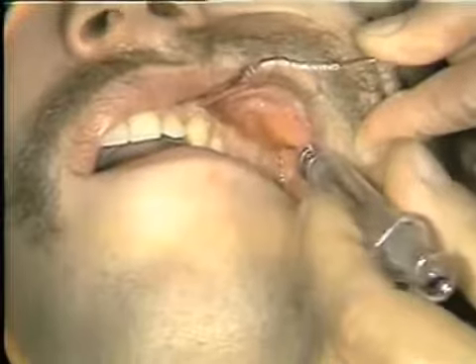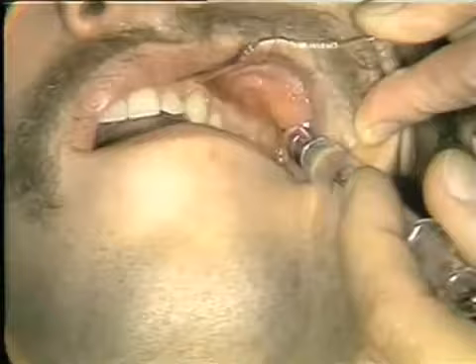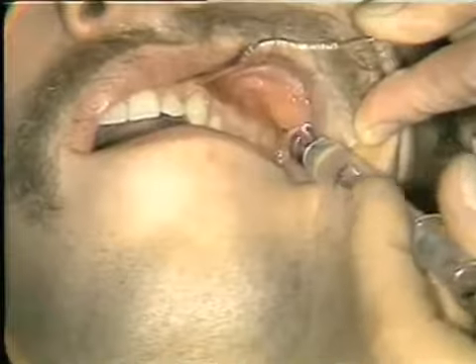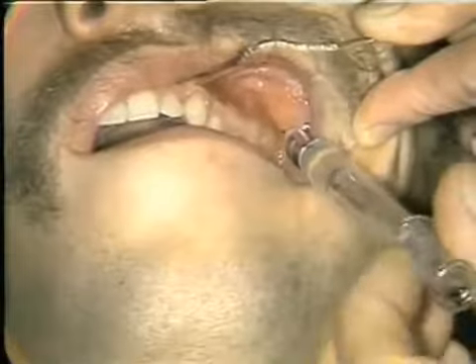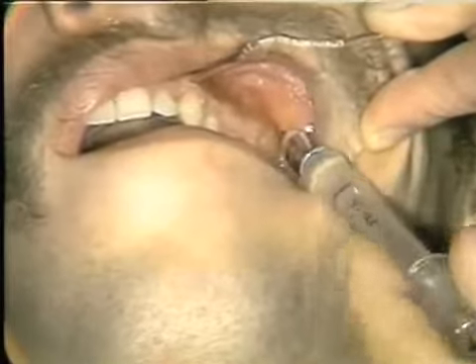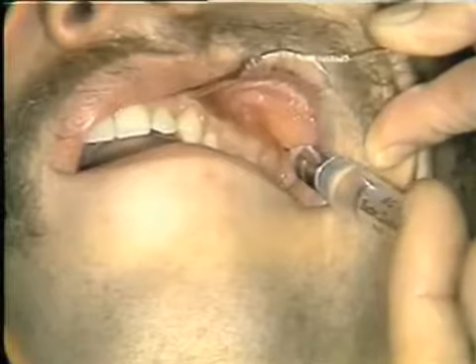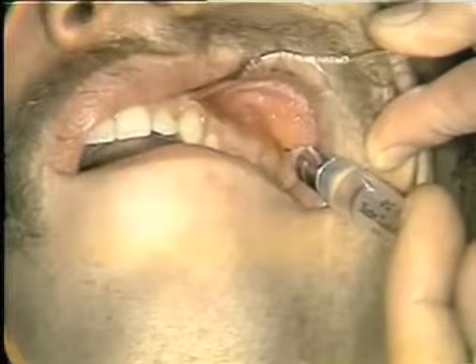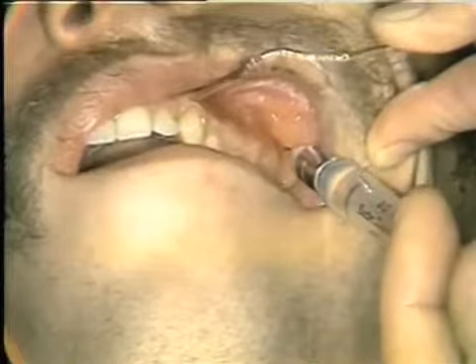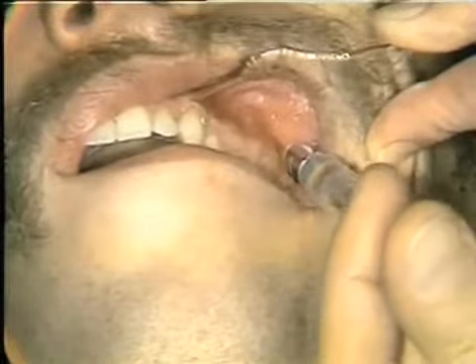And with a light touch, we can actually feel the needle bevel penetrate the buccinator muscle, and we know that we've gone far enough superiorly. All right, we'll aspirate here a little bit. We're in good position. And now we will very slowly deposit about 2 cc's of solution. This should be adequate for the posterior superior alveolar injection.